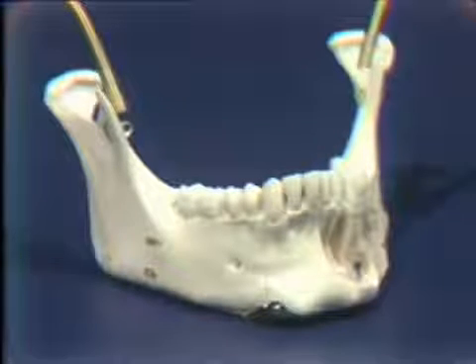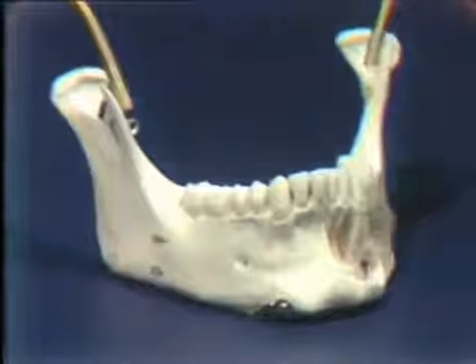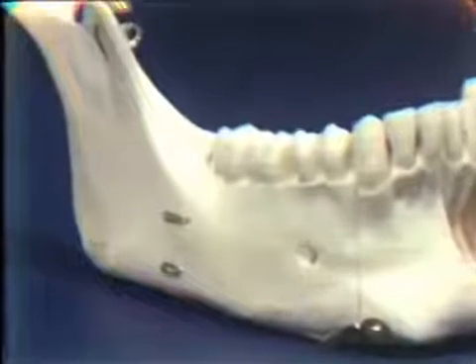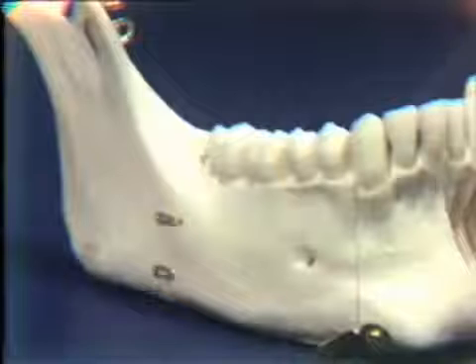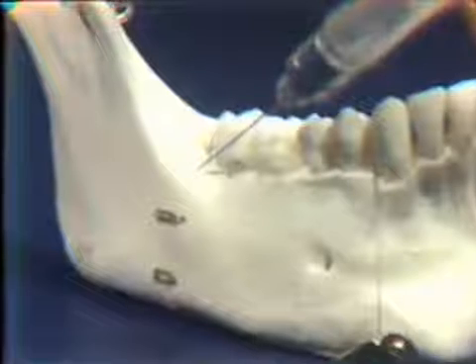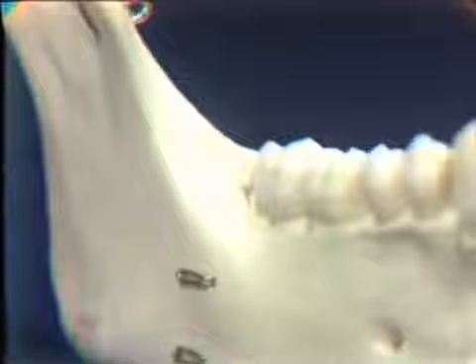Let me just demonstrate briefly here now on the mandible approximately where we would inject to give the long buccal injection. With the mandible closed slightly, or approximately halfway, we would retract the cheek and put a little tension on it so that the vestibular tissues are tense. They are taut. And our injection site would be approximately at the distal aspect of the second molar. Now, many times it is not necessary that the needle bevel be against bone for this injection, since these nerve fibers are very close below the surface of the mucosa.